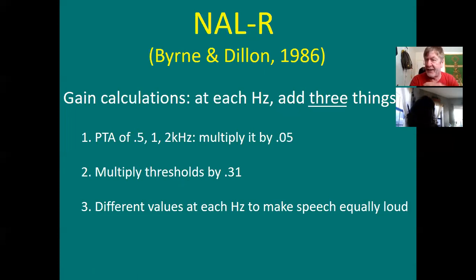And your computer did it all. You didn't sit there adding this up. It was done automatically on your computer. So when you did real ear, you just pushed a button. You entered the guy's audiogram into the real ear system. You chose your fitting method, whether it was Berger, POGO, Libby, NAL. You entered the guy's hearing loss in, and then you just pushed enter. And the computer went, brr, brr, brr, brr. Okay, there's your target. Did you want your Berger target, your Libby target, your POGO target, or your NAL target?